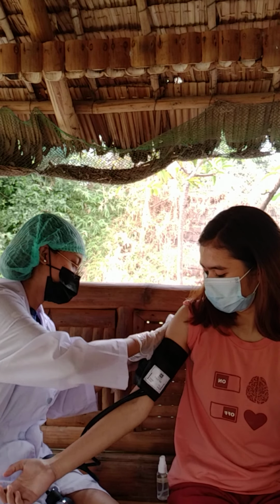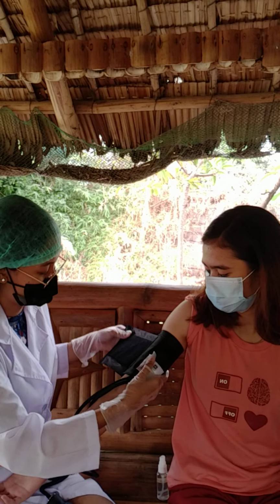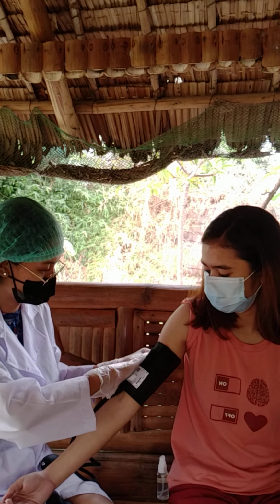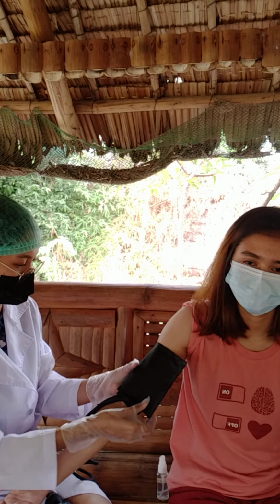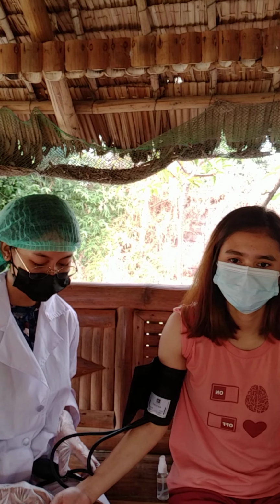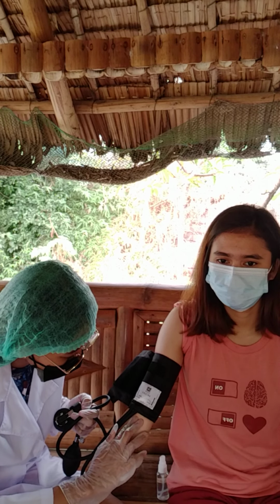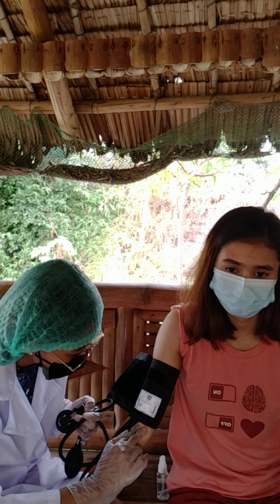Medyo mapayat yung patient natin, kaya so yan, nakabit na natin siya ng maayos. So, kakapain natin yung pulso dito sa may niya, antecubital.